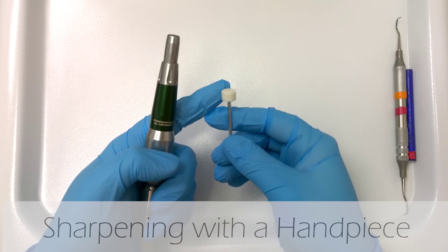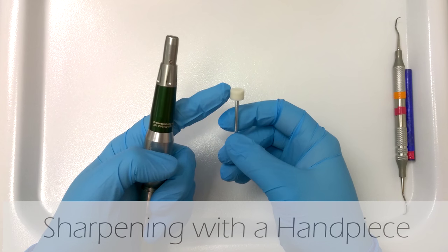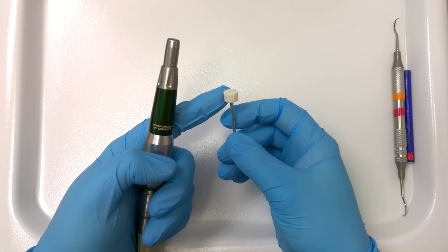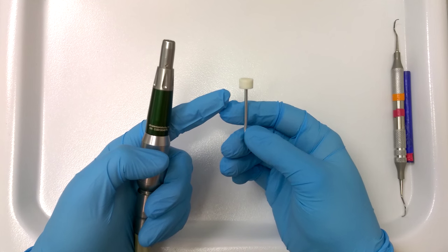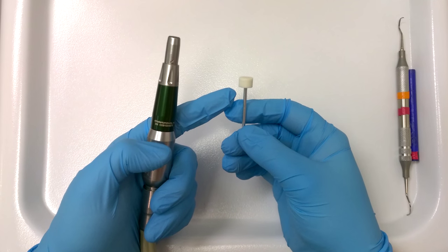You can buy them from any of your distributors online and you can get different stones if you have a particular stone you like, different grits. This one just happens to be Hu-Friedy, but all the brands make them.